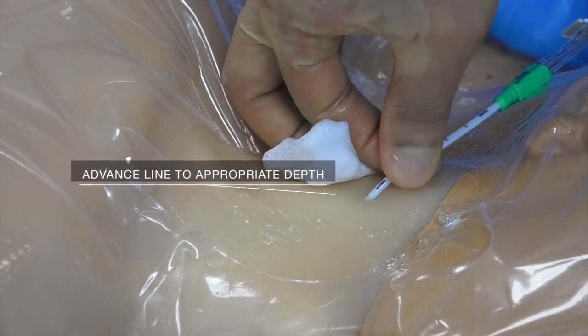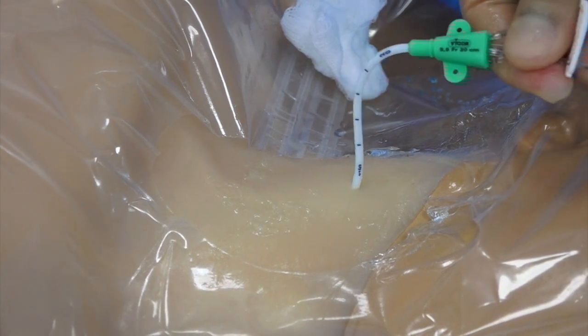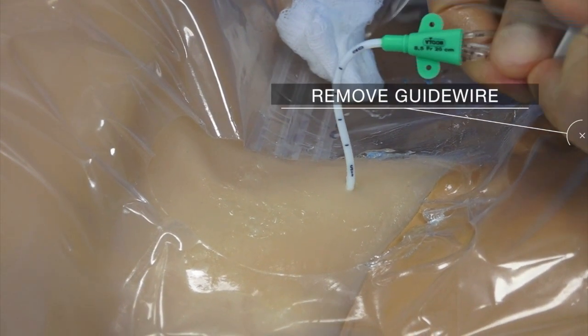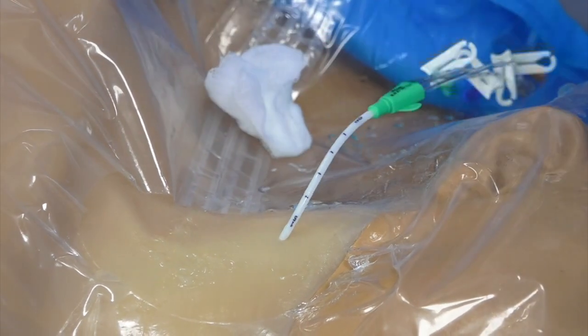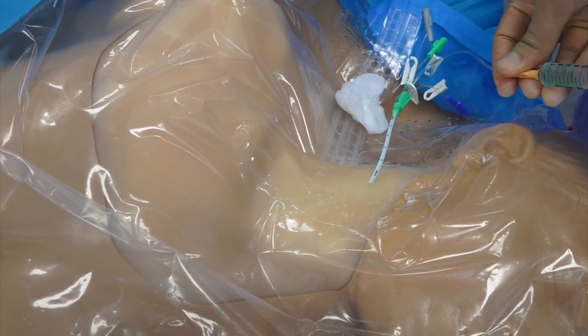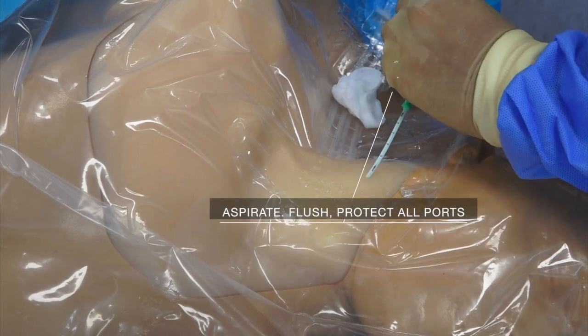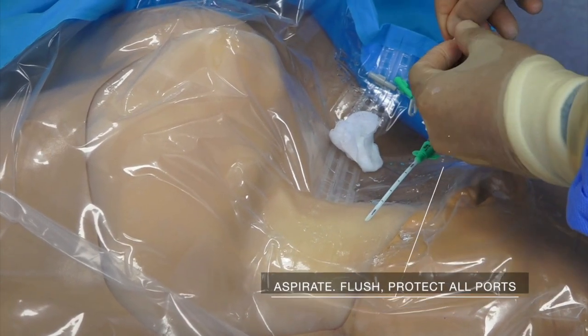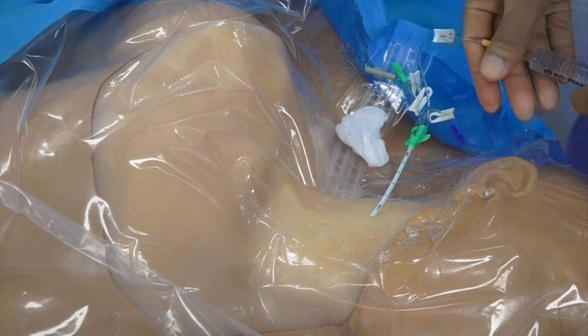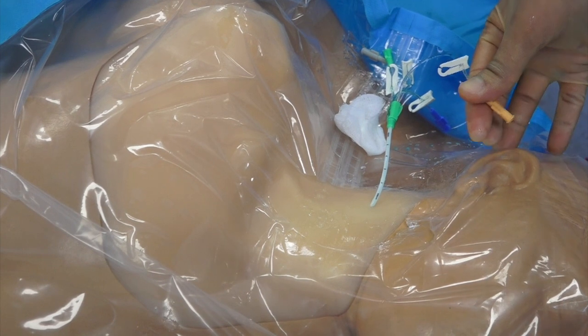Advance the central venous catheter to an appropriate depth. The appropriate depth is roughly 15 cm for an adult male. This depth can be increased or decreased based on the patient's size. Remember to remove the guide wire. Aspirate all ports of the central venous catheter ensuring venous blood flow, then flush all ports with sterile normal saline. Protect all ports with a sterile three-way connector or a sterile bung.